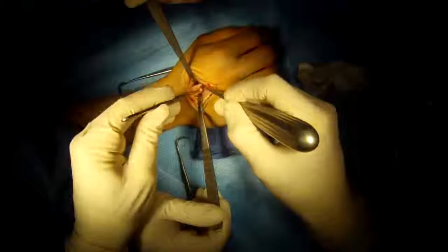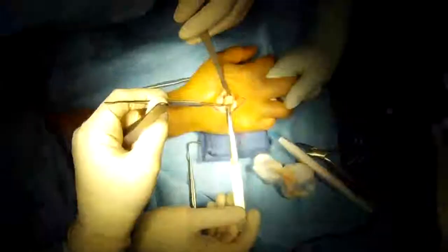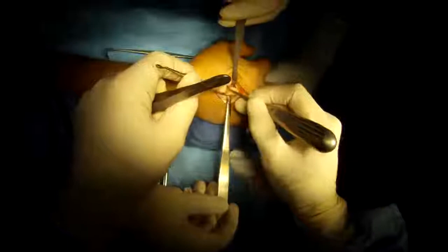You can see the fracture — the bone is broken. We're going to clean it up, make sure there's no soft tissue in the fracture so that we can reduce it. I'm just going to use a little shoehorn device to expose the other end so we can clean that end off too.